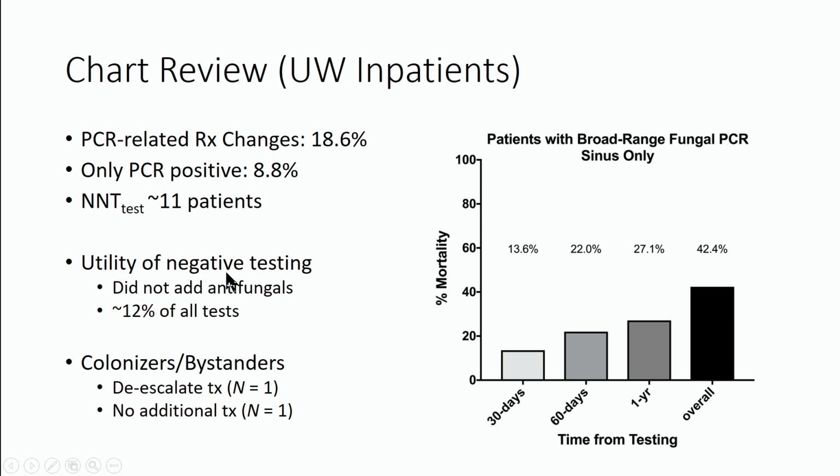There are a couple of other points I want to make, which is that negative testing is still valuable. There were a number of cases, about 12% of all the tests ordered, where the clinicians were more comfortable not adding antifungal medications because the testing was negative. Some of that includes culture results, but one of the big advantages you have from the broad-range fungal PCR is we result it potentially weeks faster than a negative fungal culture.